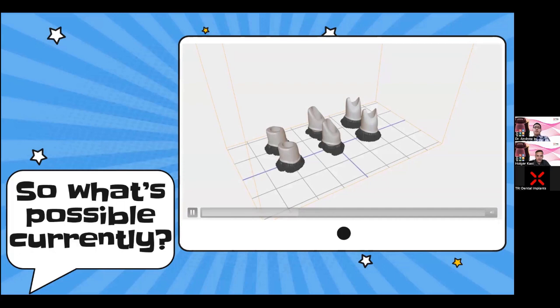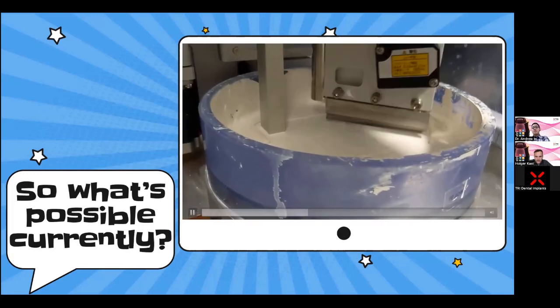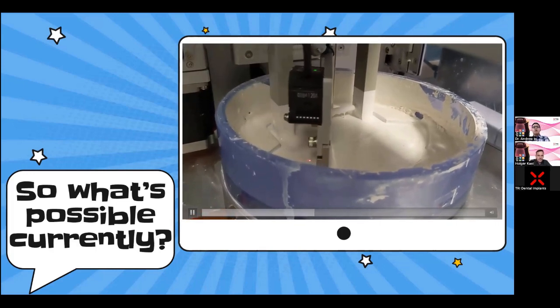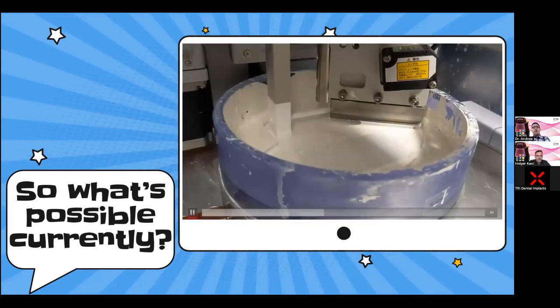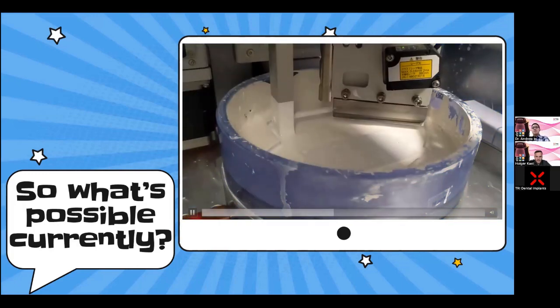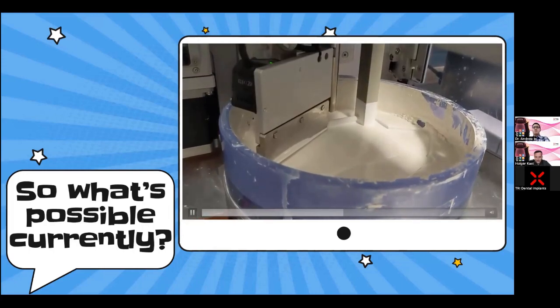Here you can see the abutments being nested. You see that I've actually printed them twice. The reason for that is whenever you start something, especially when you're new to the technology, the material cost of 3D printing is very, very low. So I printed a spare copy just in case I needed it. Turns out I didn't, but you never know when you need it, especially when you're polishing these things or you accidentally drop one, break one, lose one. It saves you the time of repeating the whole 3D printing process again. And as I said, the material cost is quite negligible.